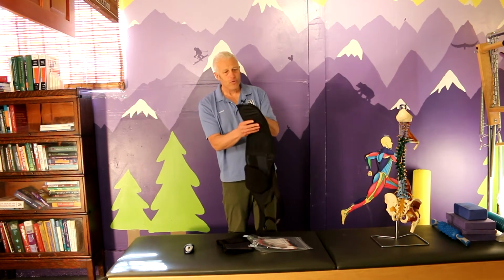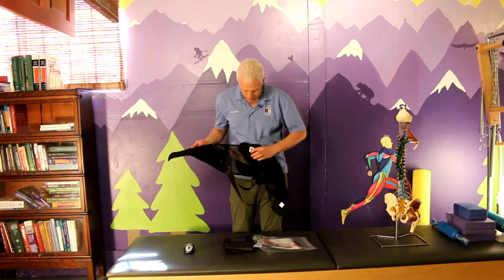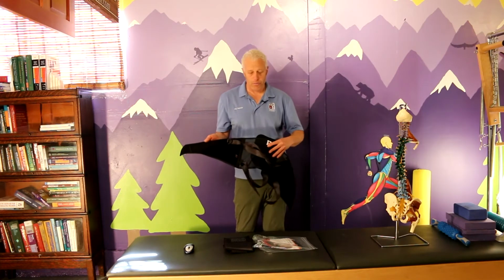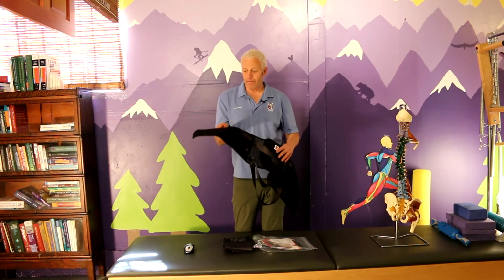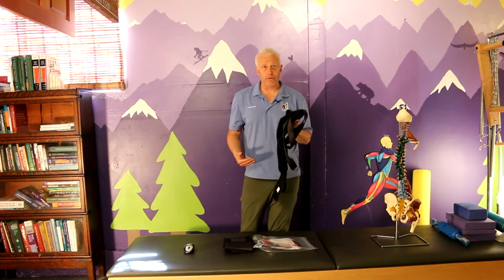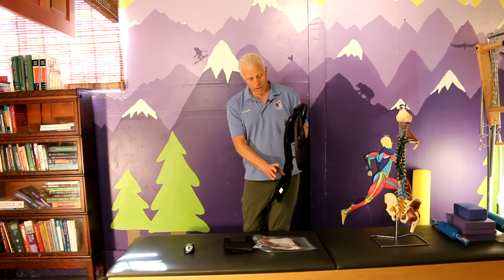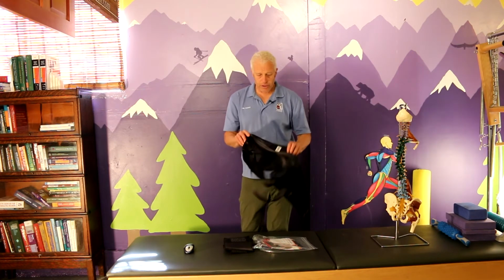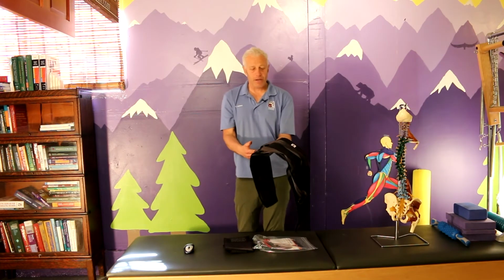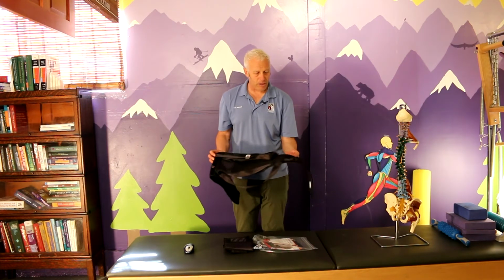When it comes to which side you want to put on, you want to make sure that the label is on the correct side, and that way you can make sure you're putting it on right side up. Where you put it is going to be important. Let me go back. In addition to those, you can see it has these reinforcing stabilization straps, so you can leverage yourself and get some more tightness.